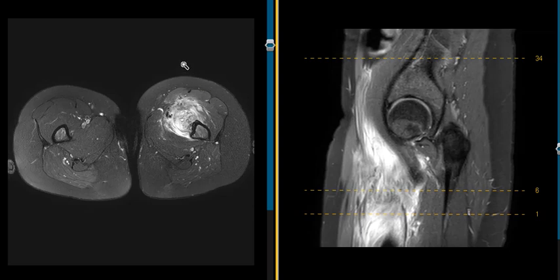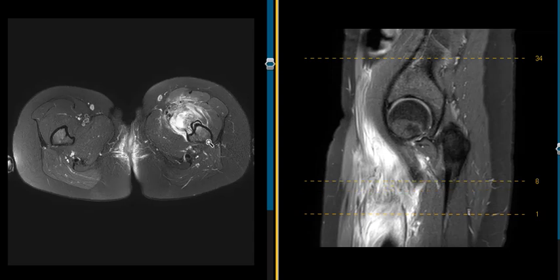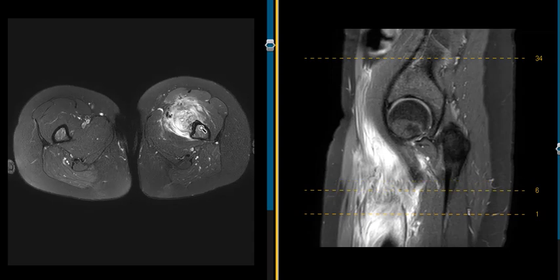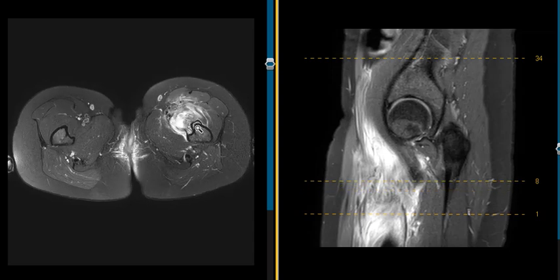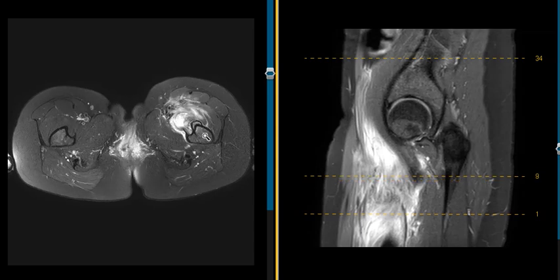Luckily she has a history of prior blunt trauma to the region, and we're going to look for some other signs. A big sarcoma generally will cause edema in the adjacent femur — this is the femur here — we'll see bone destruction and edema, but in this case we see just the opposite.